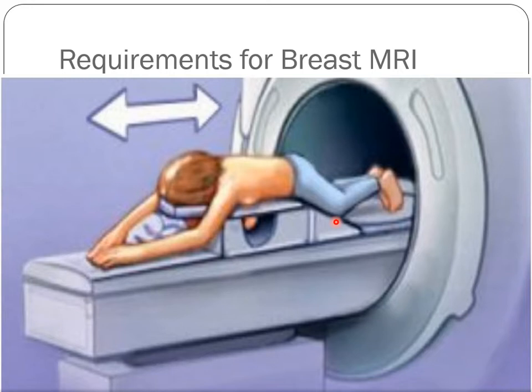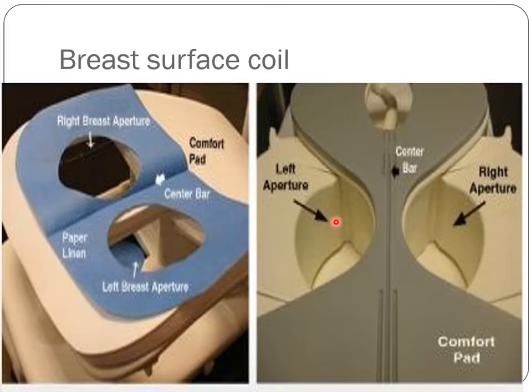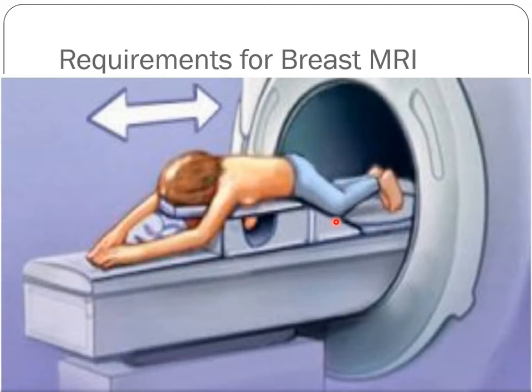The advantage of this position is that it lets the breast tissue separate freely and decreases as much as possible the motion artifact that occurs during respiration. Just one note, please go back. First of all, normally, routinely, during our practice, we use this position but head first, not feet first.